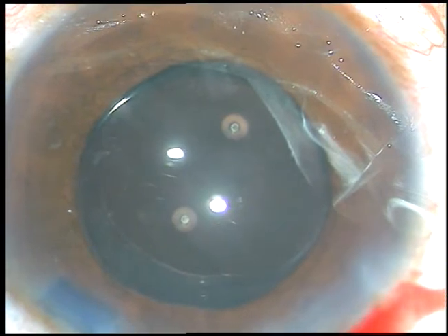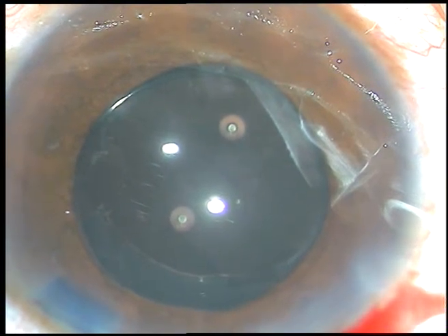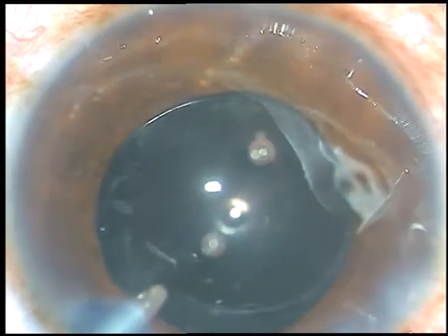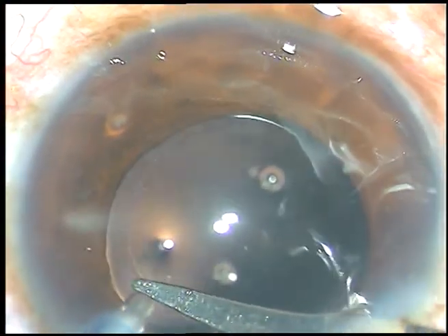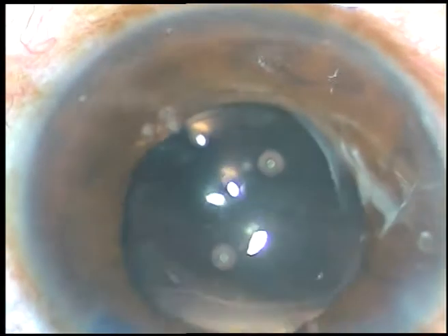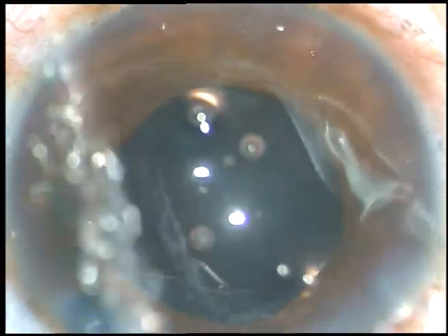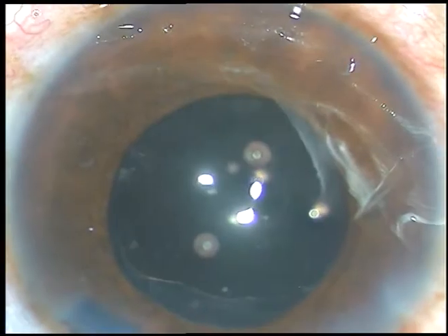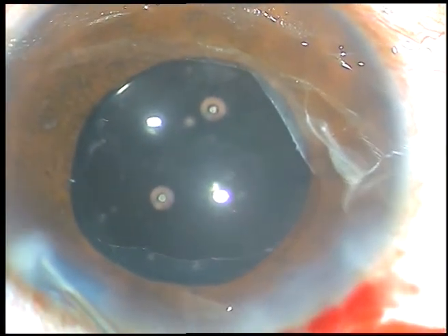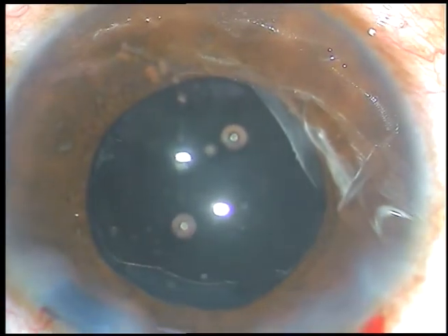However, I want to enlarge the rhexis to prevent capsular phimosis. Again, I keep the anterior chamber formed by the irrigating probe, use a Vannas scissor to cut the rhexis margin at 2 o'clock, then use the Utrata forceps to enlarge the rhexis. So we can always enlarge the size of the rhexis to prevent capsular phimosis.